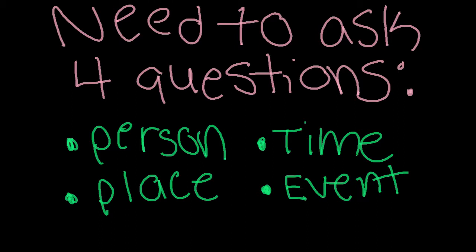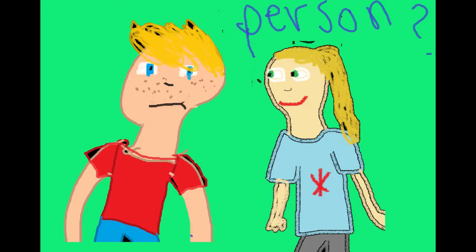Testing for altered mental status is one of the first parts of your patient assessment for all your patients that you will treat.